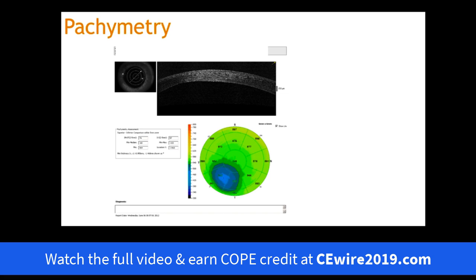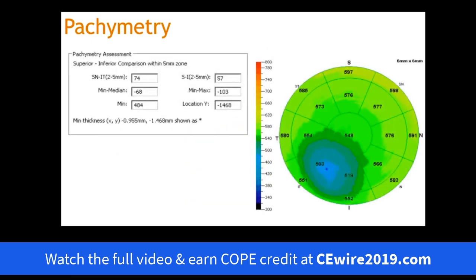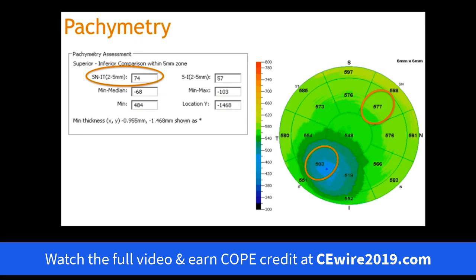What's interesting in this particular scan is you can see some thinning inferiorly in this individual's eye. This is one of those things we started seeing and realized we were actually catching subclinical keratoconic individuals — and when we performed topographies on them, we confirmed the diagnosis. Alongside the pachymetry map, high-technology OCTs provide additional readings that we sometimes overlook, but in these scenarios you want to pay particularly close attention to those numbers.